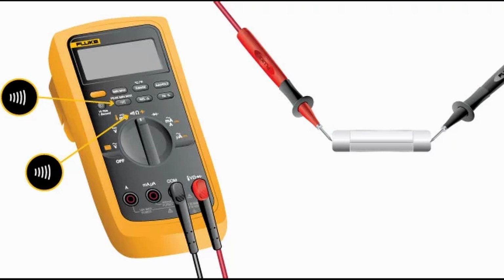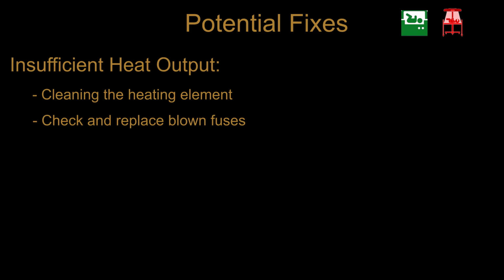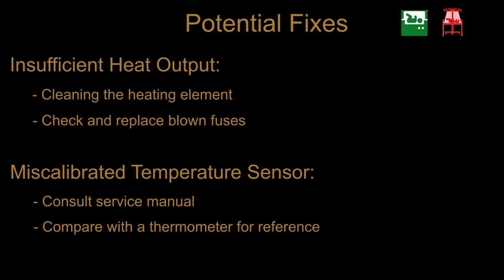Realize that you may have thermal and electrical fuses. While blown fuses can be replaced quite easily, a blown thermal fuse may indicate that heat is not being vented properly by the system. In this case, it may be necessary to replace the fan as well. If the temperature sensor is not displaying accurate readings, consult your manual for information on how to recalibrate your sensor. Each device will have its own process for resetting calibration. A reference thermometer can help with accuracy of calibration.